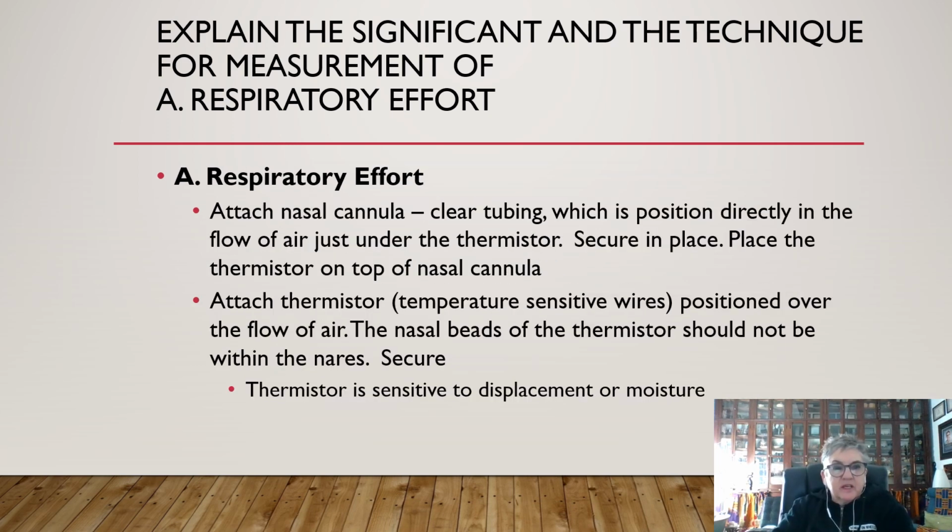Next, we attach the nasal cannula. It's clear tubing which is positioned directly in the flow of air, just under the thermistor. Secure it in place. The thermistor will be placed on top of the nasal cannula.